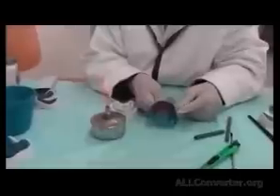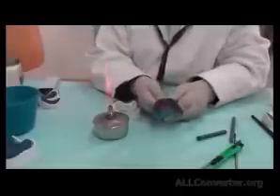So remember, when you smile, your mouth opening becomes wider because these frena push the mouth to the side. So they have some lateral movement. So when I'm mimicking the movement over the border here, I would pull the cheek not only downwards but also sideways. So I have recorded the sulcus.